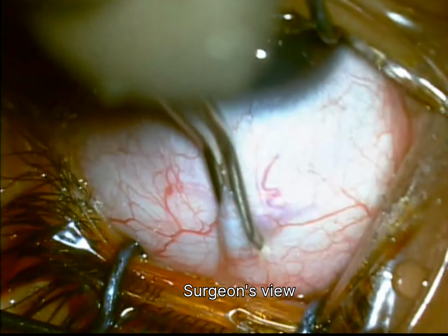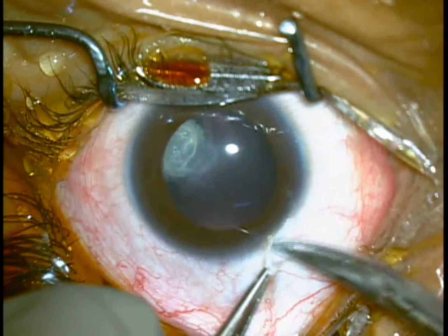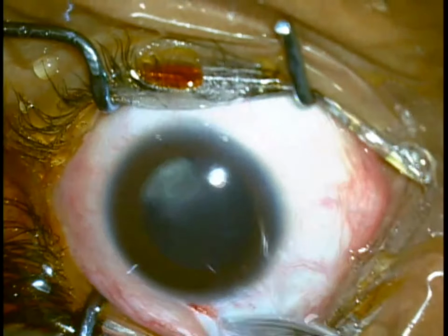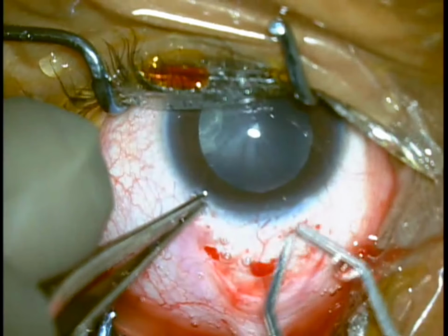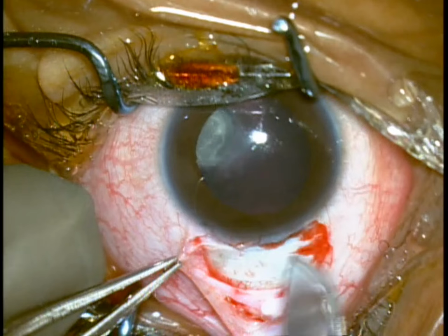The child underwent cataract surgery, the initial steps like any other routine case. Superior rectus bridle suture was applied, conjunctival peritomy done, and hemostasis was achieved with scleral cautery. Sclerocorneal tunnel was made with crescent blade.